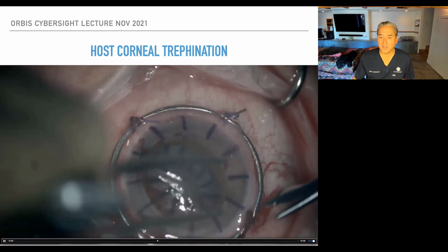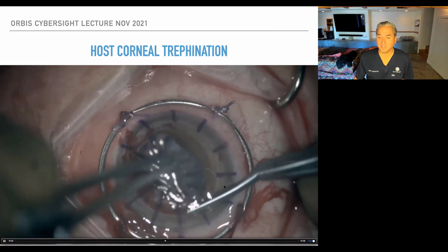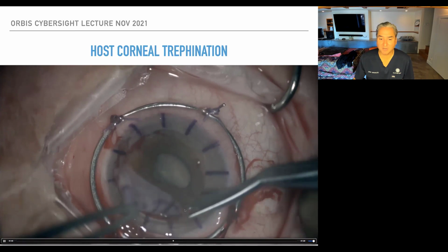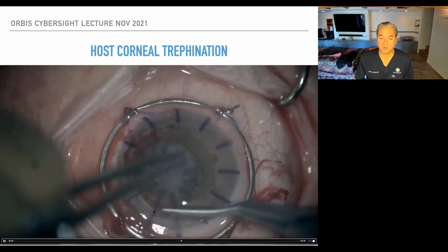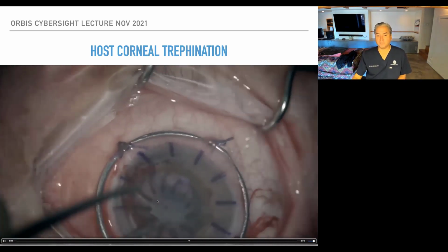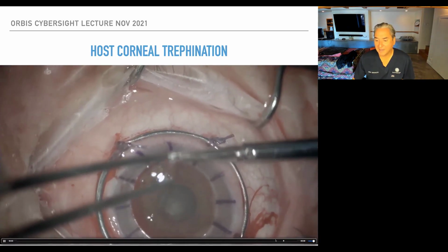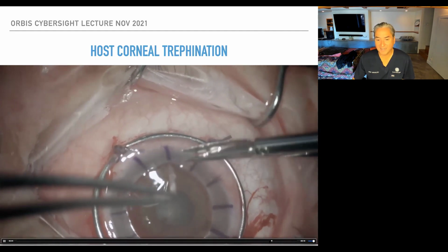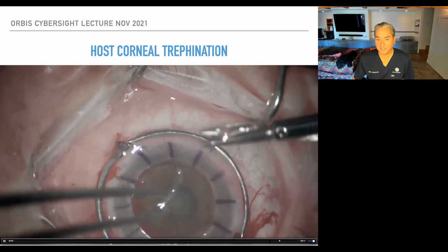So you saw that I went around to where I was comfortable in this direction, and now I'm coming back with the other direction scissors, back this way. And with my left hand, I'm retracting back the cornea, and you pull it centrally so that you expose this little gap and make sure that you're in the line that the trephine already cut. And so you want to be able to cut, and then you can go back. And if there are areas where you left a shelf that you didn't like, you can go back with Vannas scissors and cut that to get a more even graft-host interface.